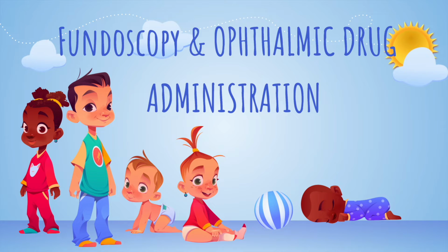Hi, good day. I'm Clerk Lakkian, and today we are going to perform fundoscopy and ophthalmic drug administration in a pediatric patient.